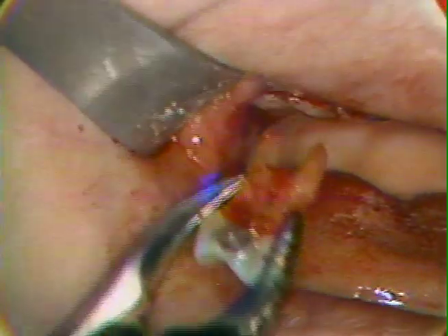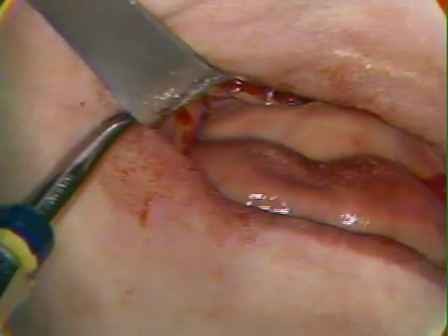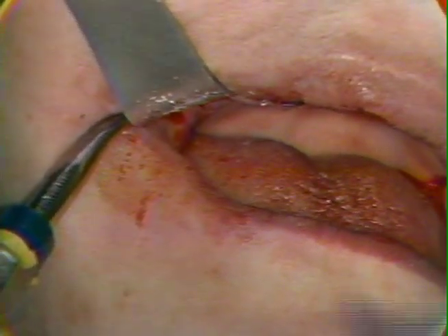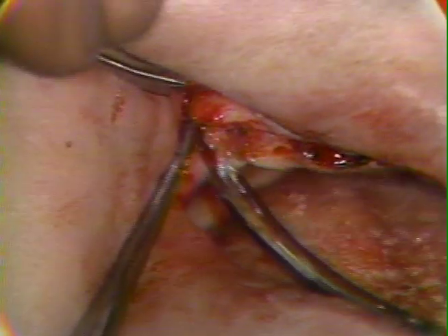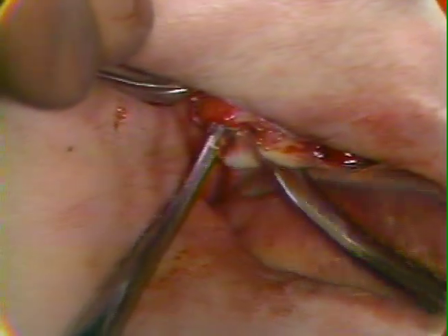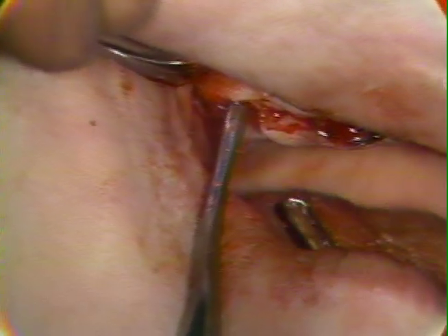Now the distal, we just cut off the mesial buccal, and we'll take this out, and the distal buccal also came along, so we have only the mesial buccal root remaining. We can suction in there once again to show us the field. And I'll use a periosteal elevator to more adequately control this flap, which is otherwise escaping.